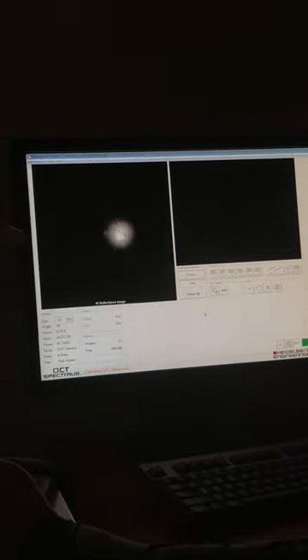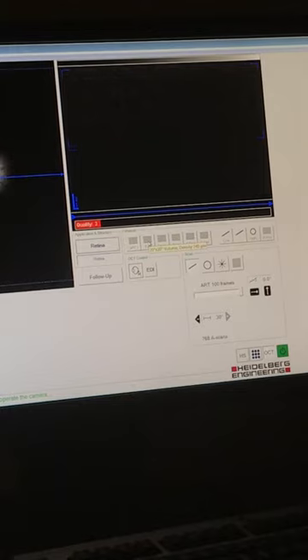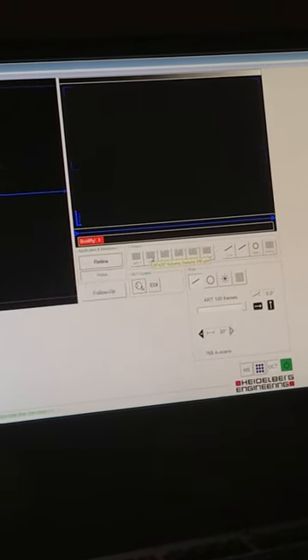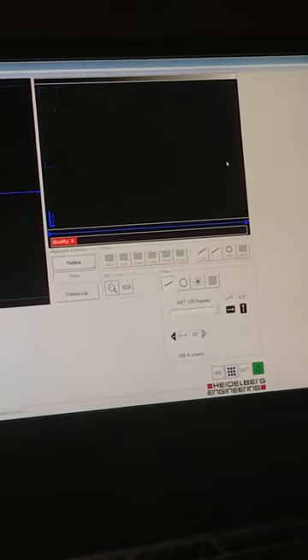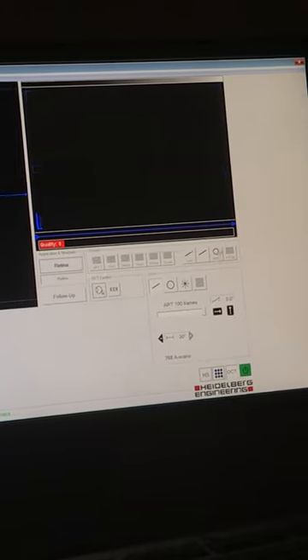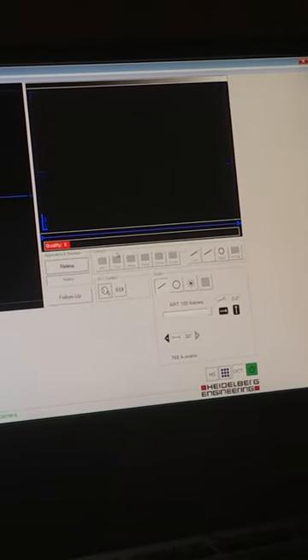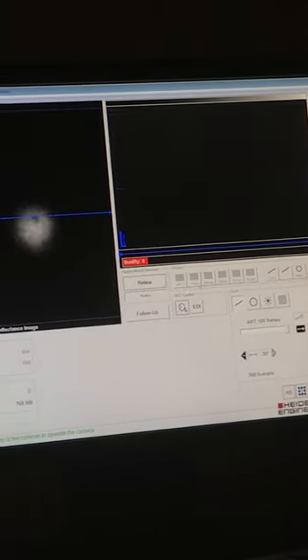For an OCTR, we're going to click on the FAST icon, and that will scan through the macula. For an OCTG, we'll click on the RNFL icon, which will scan the nerve fiber layers. We'll do an R first.